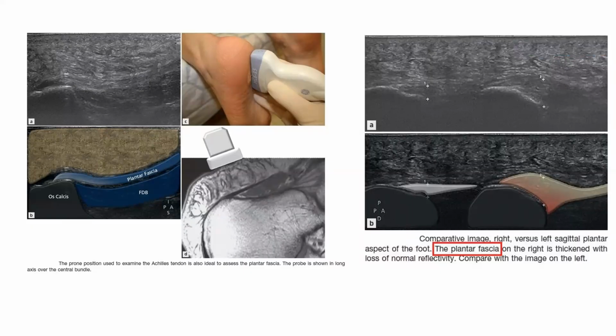Generally, for ultrasonography we use the normal jelly. I use lignocaine jelly, the one we use for catheterization. Sir, is there a possibility that we get those sterile jellies that are usually shown in the videos? Is it available in India?